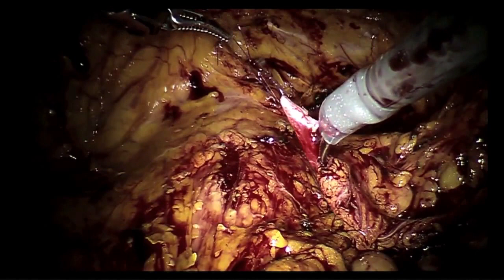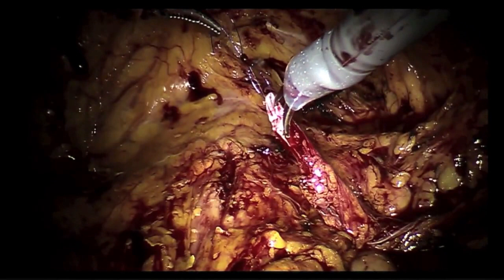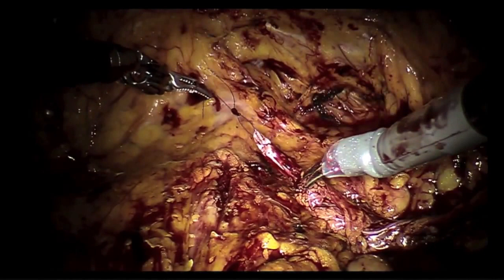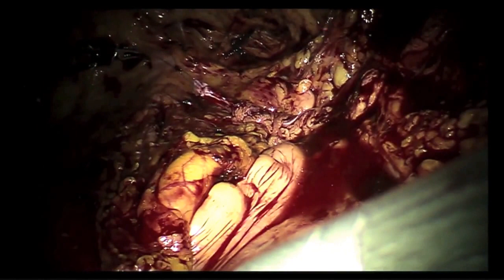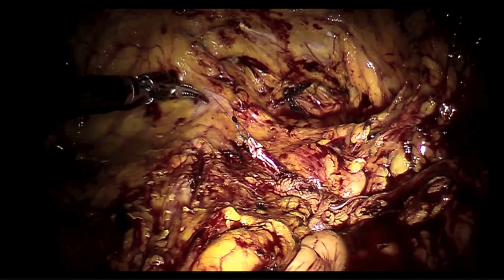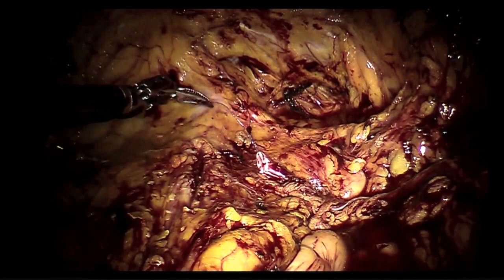Dr. Gill, you don't put a stent in, right? Yes, we will. Routinely for the anastomosis. Okay. So needle driver, not the diamond tip, just the regular. Suture cut would be awesome if they have it. Give me a PDS. First, just a single arm PDS or anything. And then I need the double armed.